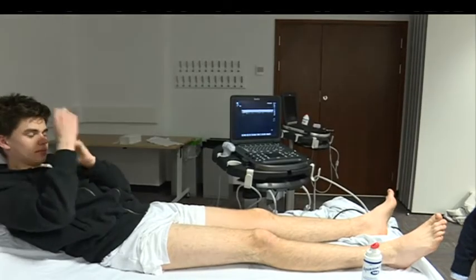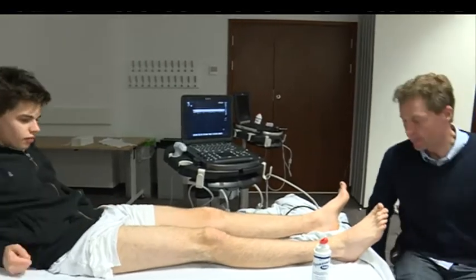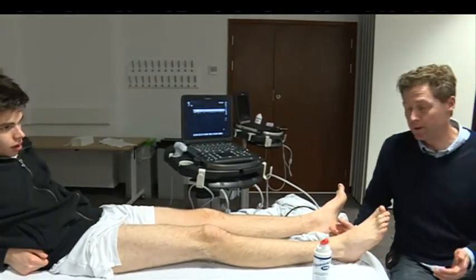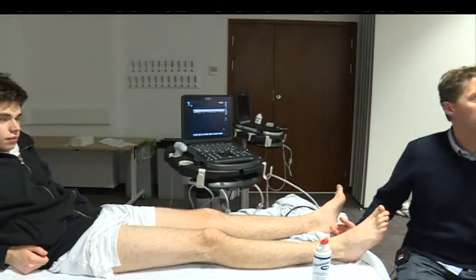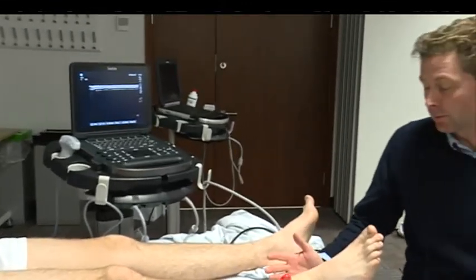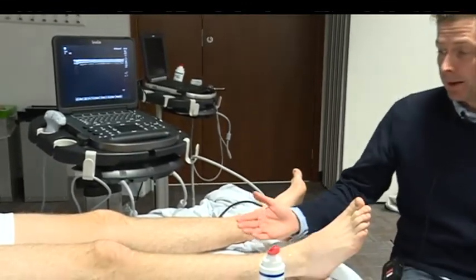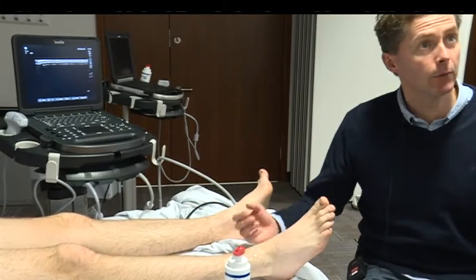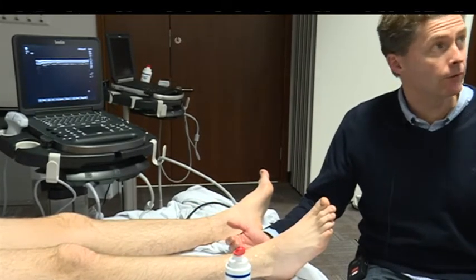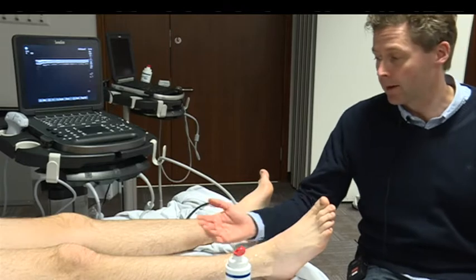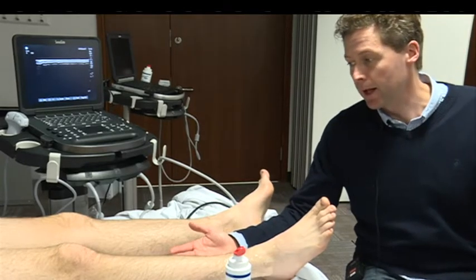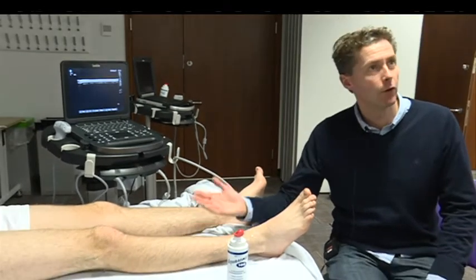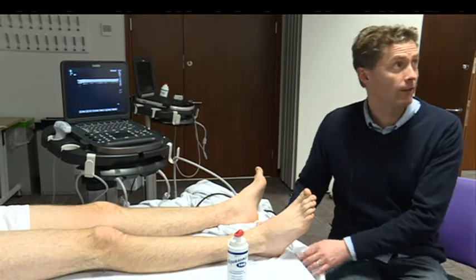There are various ways to position the patient for an ankle block. One of the problems is needling from posterior, so it's often quite helpful to have the calf on a block of some sort to lift the ankle up a little bit and give easier access.